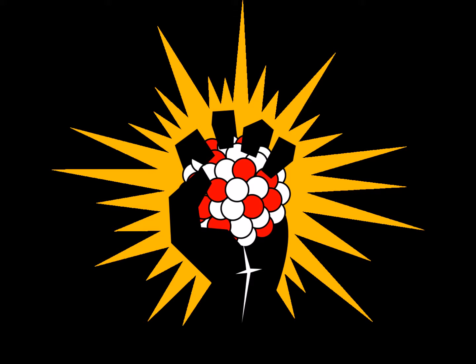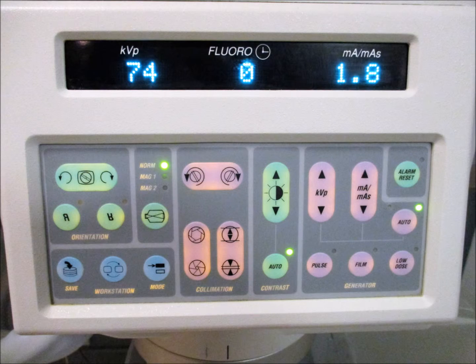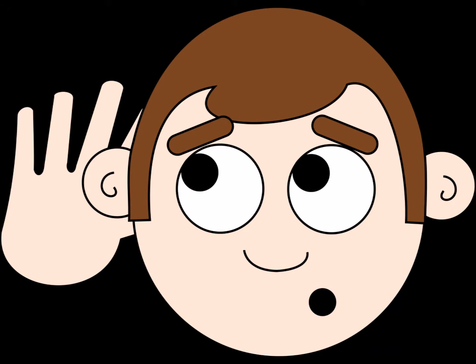I'm PD the Photon. Let me take you on this little journey that I'm on. We're gonna start with the pressing of a pedal, but first you must select the technical level. For the mA, it's 0.5 to 5, and everybody already knows the reason why. Now may I say, begin to pay attention so you don't forget what I'm about to mention.